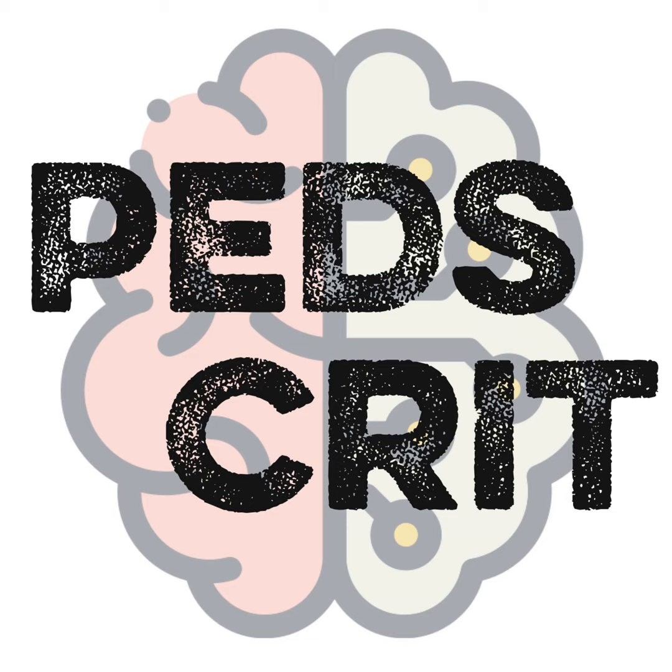Yeah. Perfect. And now in Dallas, it does sound like you have a very well-resourced decision tree because you have an ECMO specialist that you can call. In other hospitals, it might just be the primary intensivist and the surgeon. And so I'm interested in how you all talk about cannula location, and if it's you, the surgeon, or the primary team, how do you make that decision and who are the players? Oh, in terms of cannulation strategy? Yeah, in terms of where? Yeah. I think the decision about cannula size always depends on the patient, right? Their weight: neonate, infant, bigger size kids, and the nearly adult size teenagers.